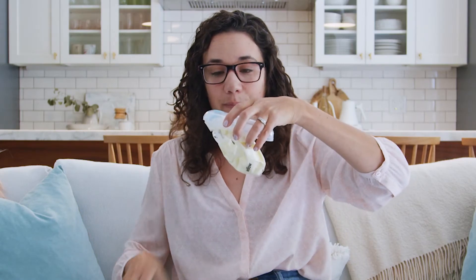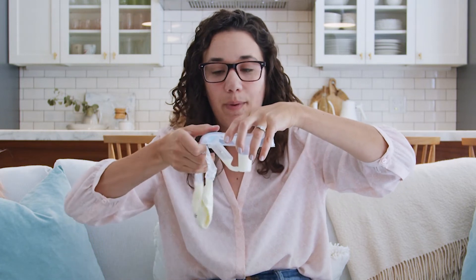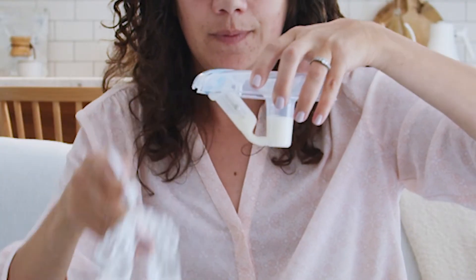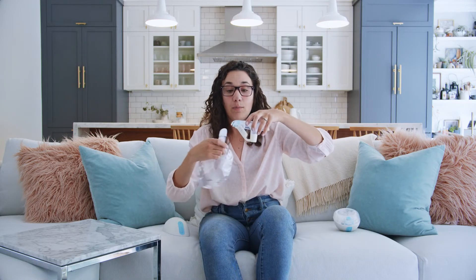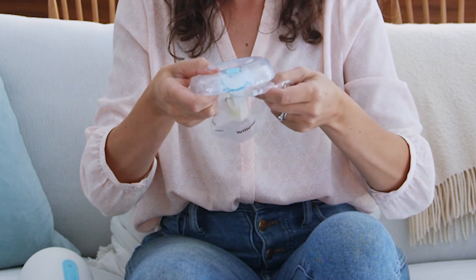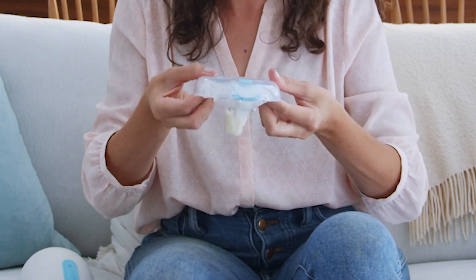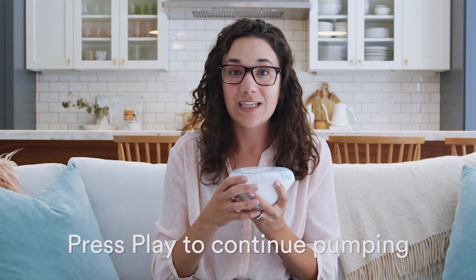Separate the pump and remove the milk bag, keeping the flange facing up. Then place a new milk bag into the flange. After replacing with the new milk bag or emptying and replacing your milk container, put the pump back together and press play to continue pumping.